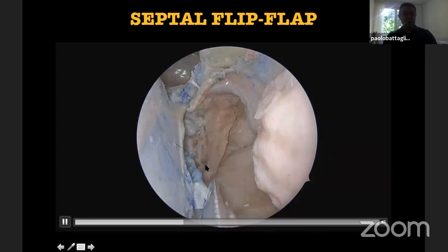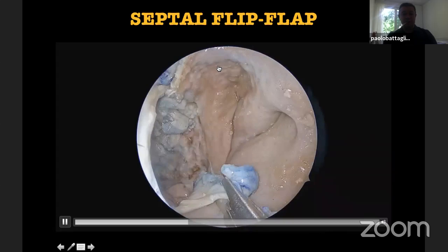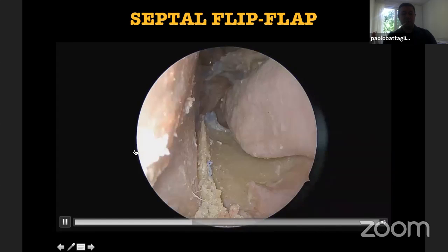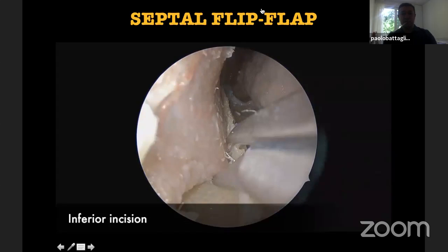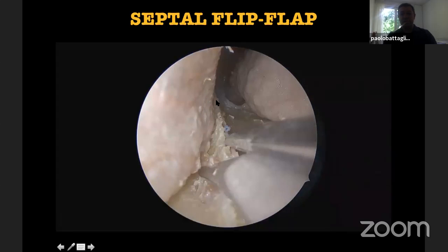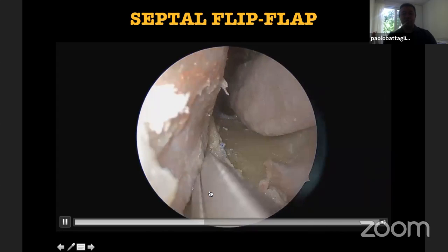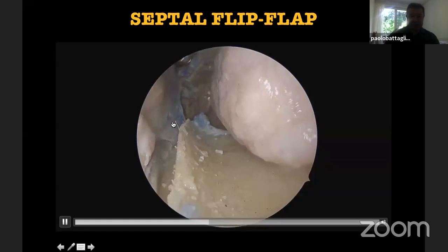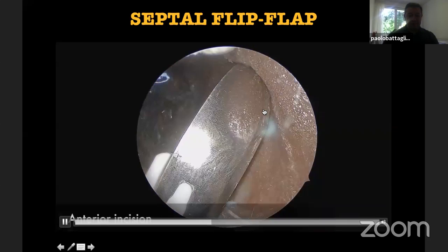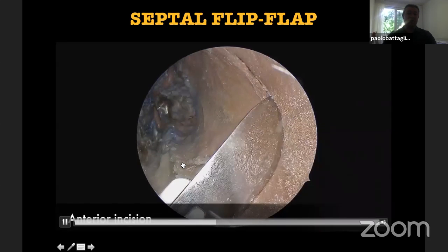Now we remain with the defect without the posterior third of the septum, and the mucoperiosteum of the contralateral side is preserved. Of course, if the tumor involves the septum, it is too risky to try to spare the mucoperiosteum. So only in case of monolateral lesion. As you can see, you can also preserve the mucosa, the mucoperiosteum that goes towards the nasal floor.